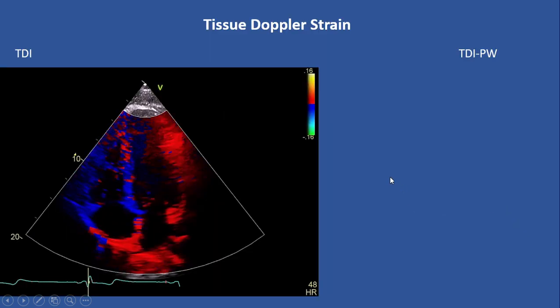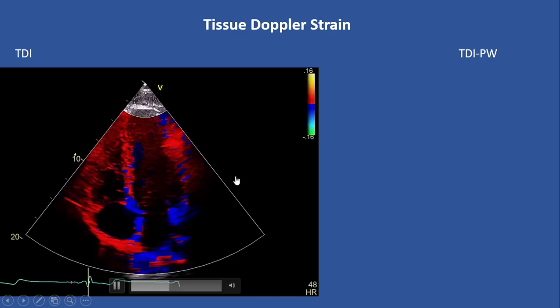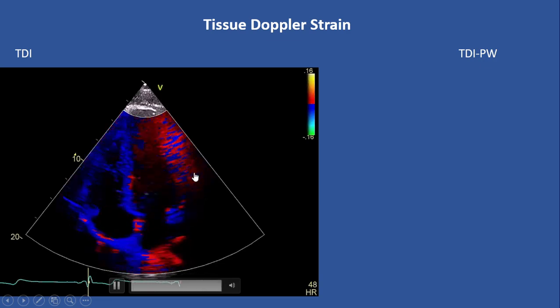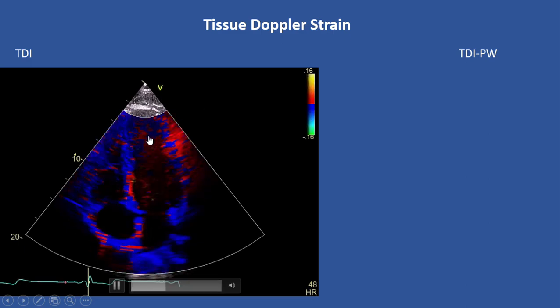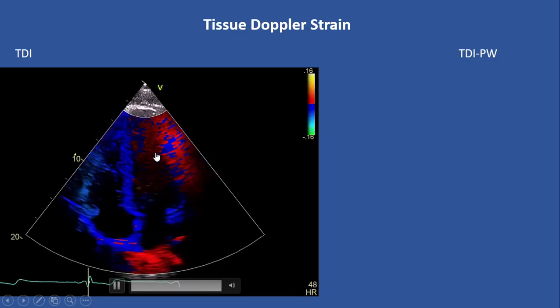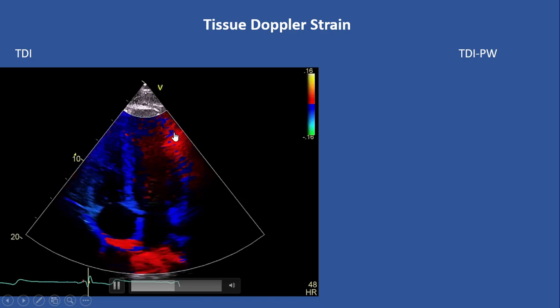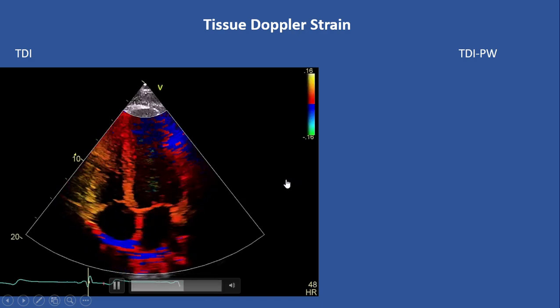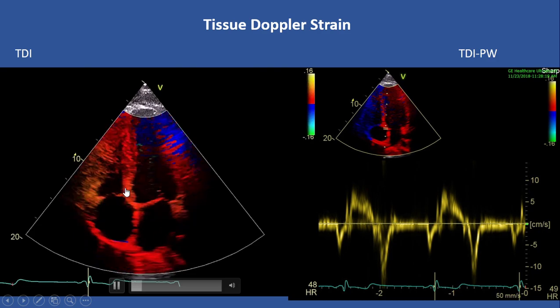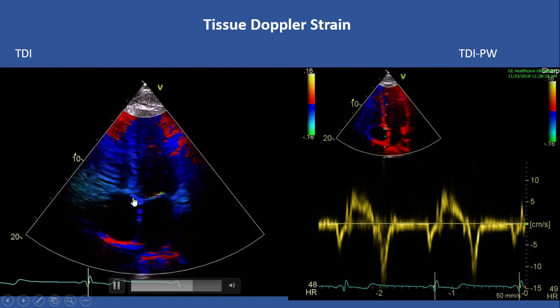Now let's see how we measure strain with tissue Doppler. In tissue Doppler, the machine or software cuts and turns off the wall filter and decreases the gain. In this way, the machine can easily detect tissue and colorize it. We no longer see blood flow, and we can colorize the tissue with this concept. If we place a sample at any spot of that wall, we can perform pulsed Doppler and measure velocity changes during cardiac activity at each spot — for example, at the medial annulus.